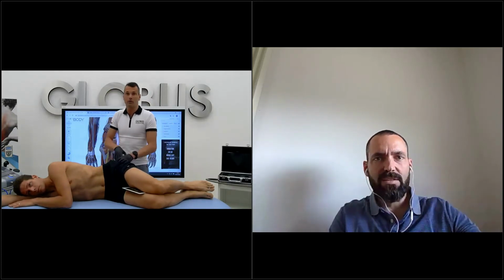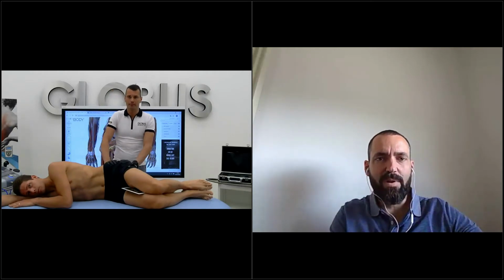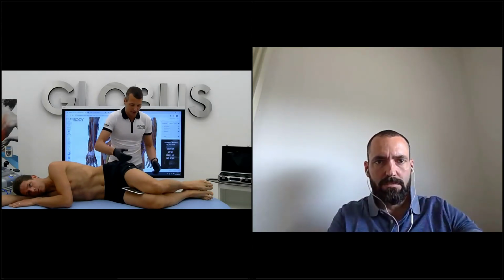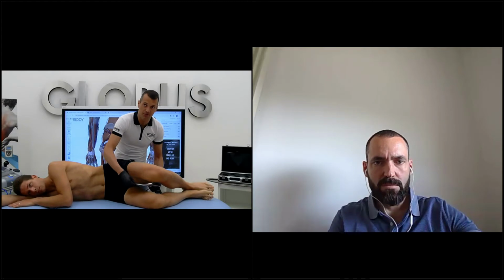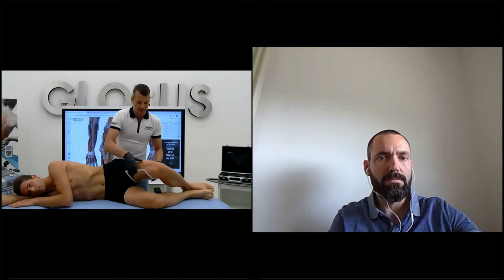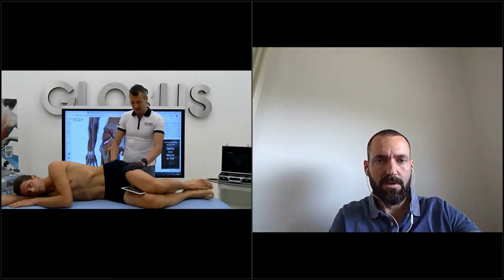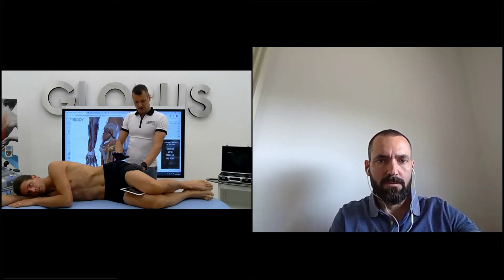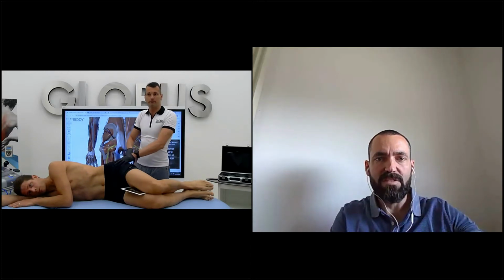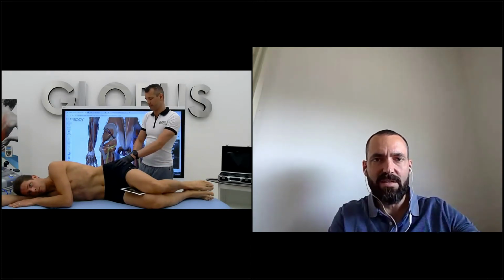By the way, here we get all. Usually, I put a towel under the plate to improve the surface touching, in this case the left leg. You're right, and this plate is flexible, so sometimes we can also bend with an elastic band around the hip, around the leg in this case. Okay, so in this position, with the trigger, I go directly.